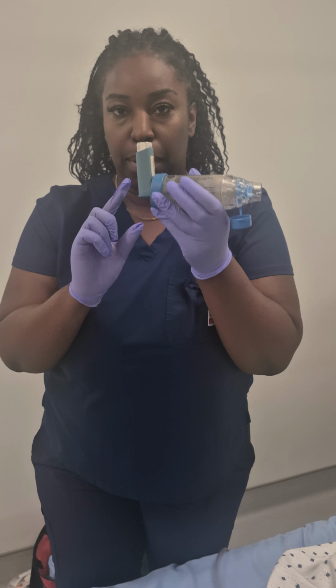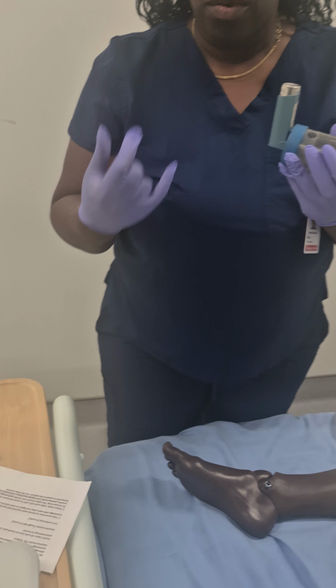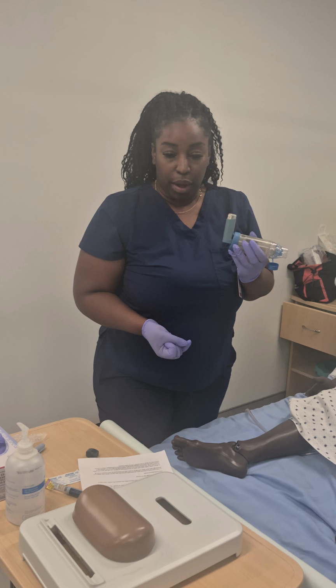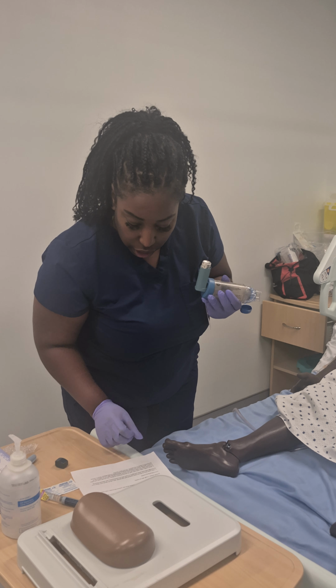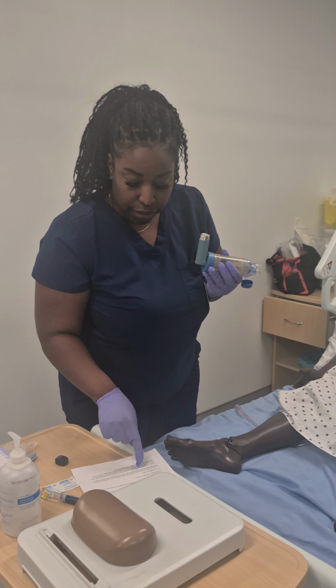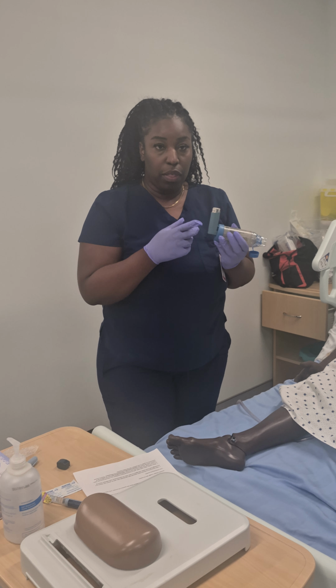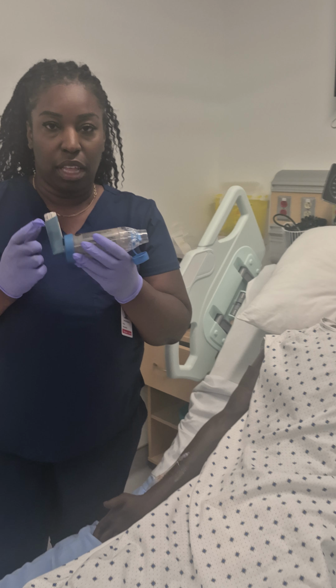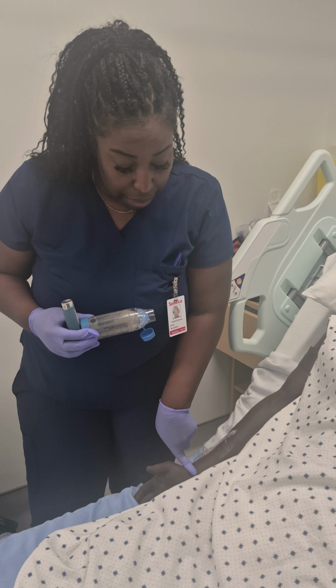So I have the Ventolin puff here, and I'm going to confirm the details with the order: right name, right dosage, right route, the 10 rights of medication administration. So we're confirming that he's going to receive 2 puffs per mouth. Okay, so I have the Ventolin, the name is there. I'm going to confirm the 2 identifiers for the patient, name and date of birth.